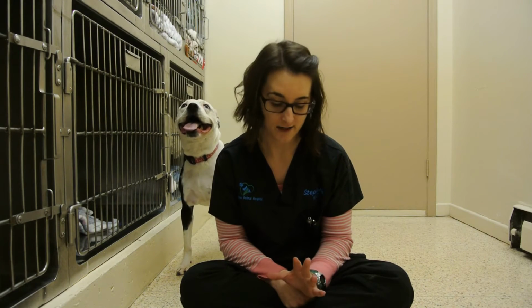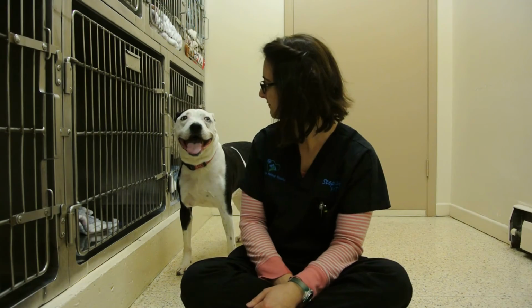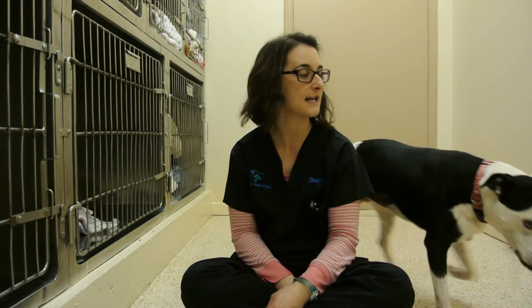We did good. Preliminary results show that her liver has a couple of spotty areas and is a little enlarged, and one of her adrenal glands looks to be enlarged. With ultrasounds and x-rays, we send them off to a radiologist for detailed analysis, and we're going to get that back. The next step for her is some blood work, which we're going to perform next week. It's a specialized blood test that has to be sent out to a lab, so we need to order some special things for that. I will keep you posted on how things go. Meanwhile, she's acting happy, and we're going to keep on keeping on. I'll keep you posted.